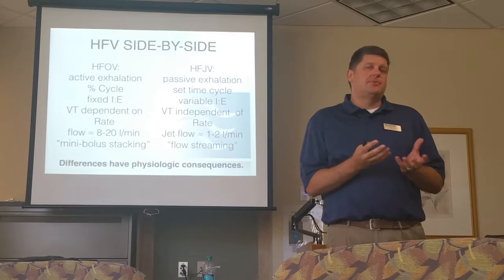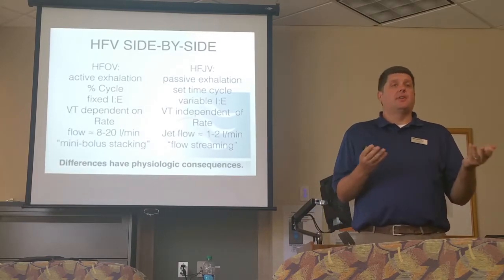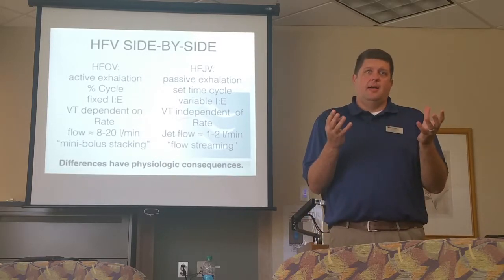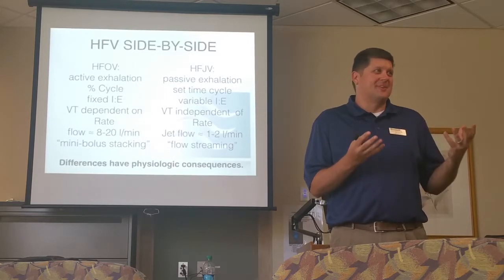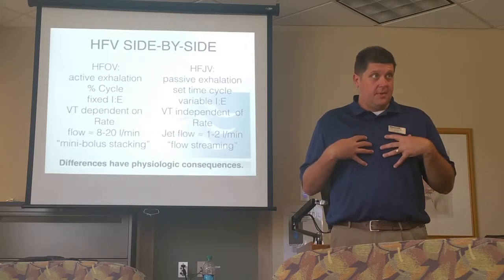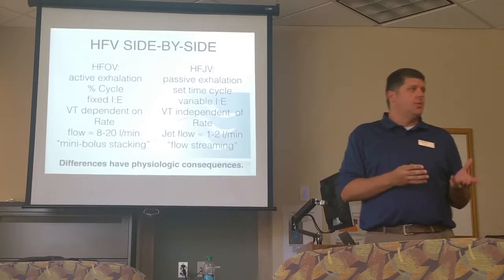And so most often, when I ask what are differences between the two machines, people will refer to passive versus active exhalation as being a difference, and it is. It's the most popular answer, but I don't think it's the biggest difference. What makes a difference pathophysiologically to our patients are the next couple of lines down. It's how the machines actually work.